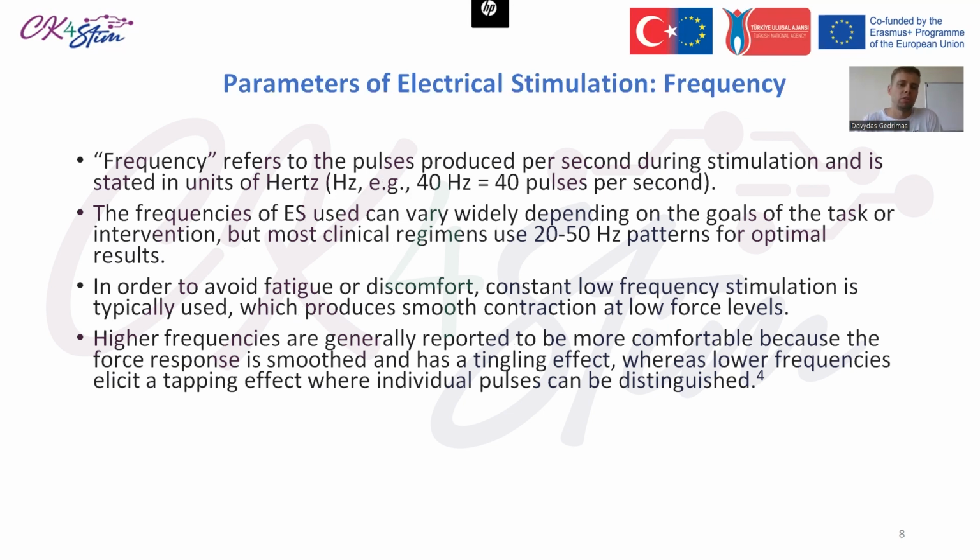In order to avoid fatigue or discomfort, constant low-frequency stimulation is typically used, which produces smooth contraction at low force levels. Higher frequencies are generally reported to be more comfortable because the force response is smooth and has a tingling effect, whereas lower frequencies elicit a tapping effect where individual pulses can be distinguished.